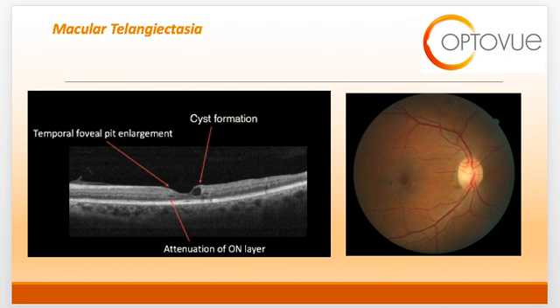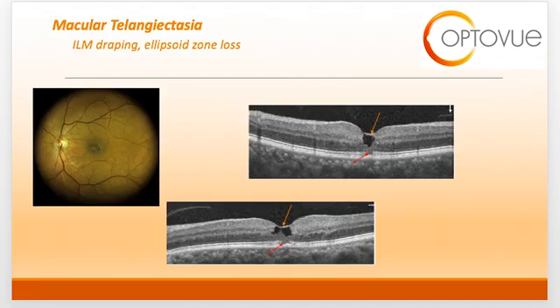On the left-hand side, you can see the early OCT signs of mactel. These include temporal foveal pit enlargement, secondary to loss of the outer nuclear layer and ellipsoid zone, that eventually can progress into cavitations or cysts on the superficial part of the OCT scan. You can see on this scan that I have delineated the cyst formation, the temporal foveal pit enlargement, and the attenuation of the outer nuclear layer. Often, only the internal limiting membrane is left in place over these areas, lending to the term ILM drape.